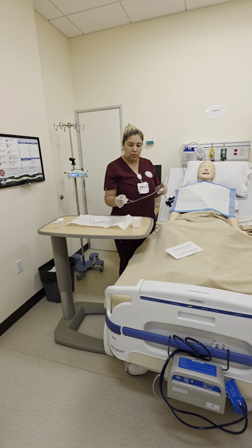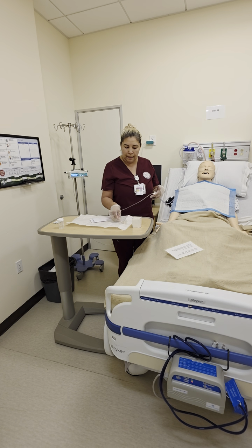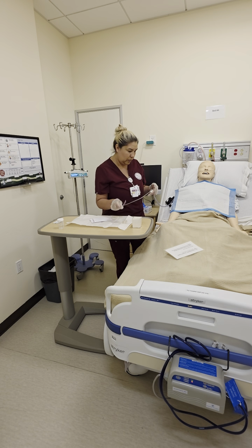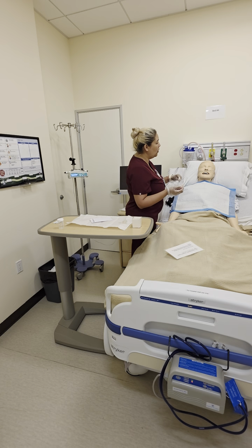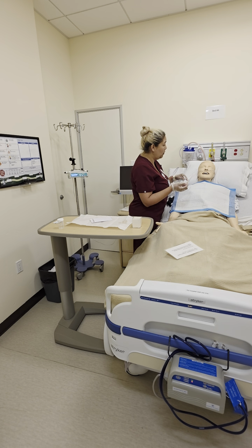I'm going to test my tubing now, dip it in water. I could see that it is suctioning. I'm going to put it in KY jelly. Okay. And now what I want to tell my patient is, go ahead and take a deep breath when I tell you to. I'm going to remove the nasal cannula, and then I'm going to be inserting the tube down your nose, okay? Okay, go ahead and take a deep breath now.